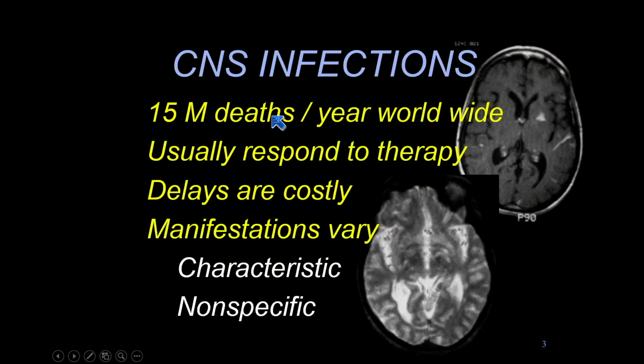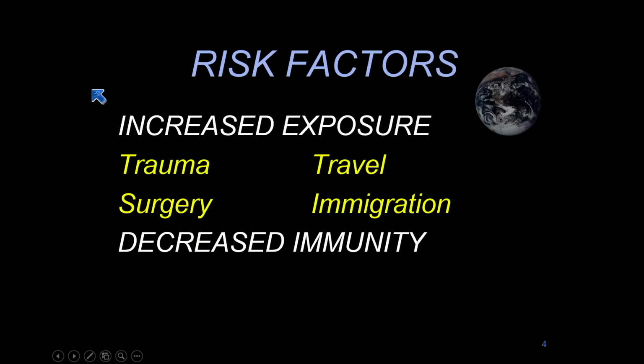So it's important for us to be aware of some of the specific signs of certain infections that affect the CNS, and also be aware that there are a lot of non-specific sequelae that can impact the imaging appearance of CNS infections. There are a number of deaths worldwide due to CNS infections, which again are often responsive to therapy if we recognize them and institute that rapidly. And we'll look at some of the manifestations here this morning.